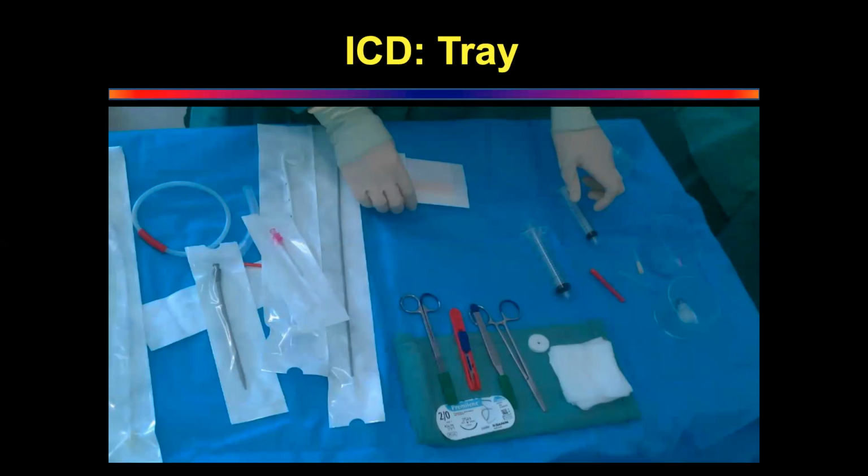This will open the area where you want to insert the pigtail. Vivek, we've done all that. Now come directly to the Seldinger technique. You've given local anesthesia, prepared, painted, everything is done. I just want to hear the technique.